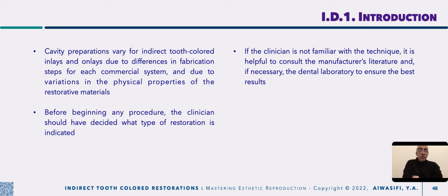If the clinician is not familiar with the technique, it is helpful to consult the manufacturer literature, and if necessary, you could also ask your production lab to ensure the best results.